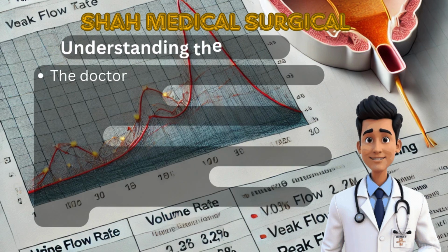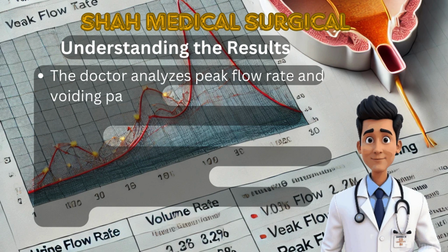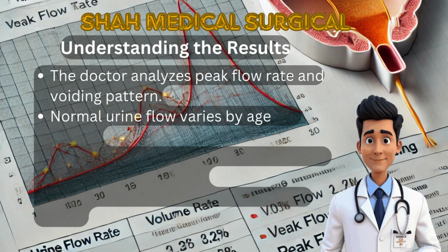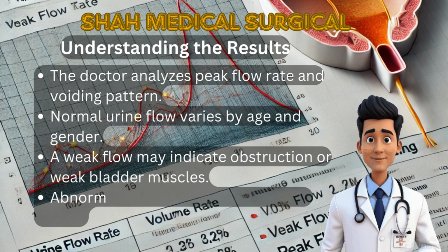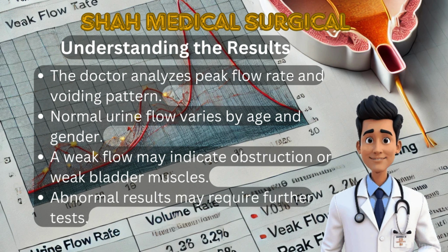Understanding the results. The doctor examines the peak urine flow rate and voiding pattern from the test. Normal flow rates vary depending on age and gender, with men generally having stronger streams. A weak flow rate may indicate obstruction or weak bladder muscles. If results appear abnormal, further tests may be needed to confirm a diagnosis.